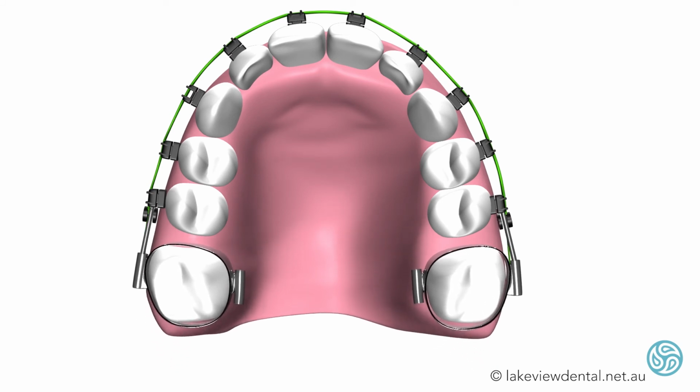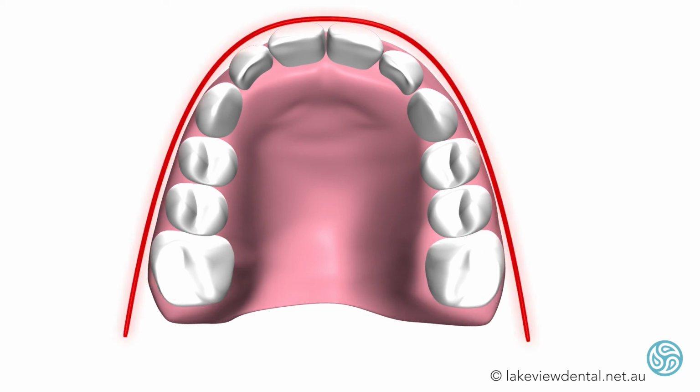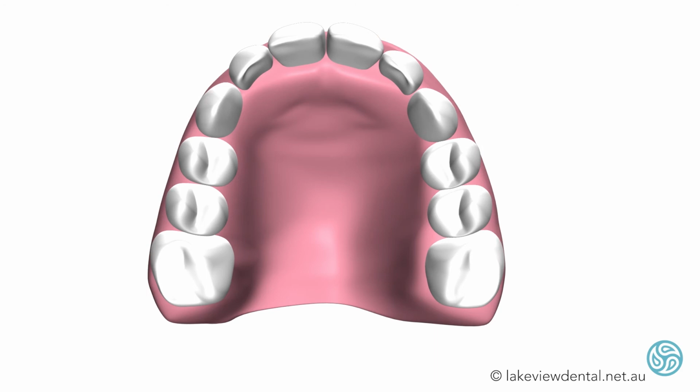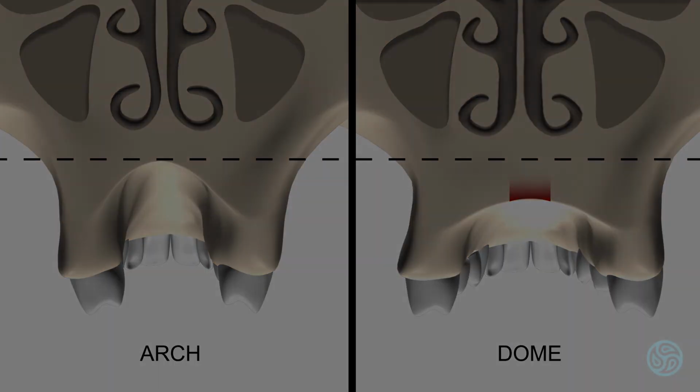The idea behind this is that in order to move the molar teeth into their rightful place, the FRLA must be removed. It is undesirable to lose the forward jaw development achieved so far, and to limit Newton's third law, some kind of anchor on the front teeth needs to apply. The stop lock serves to tie the front teeth into something resembling the sticks principle. It is easy to bend one stick, but bending a few sticks together is much harder. This allows for a wider, more forward developed arch with a potential shallower palate. It has been shown that a wider, shallower palate has a beneficial effect on the patency of the nasal passage.